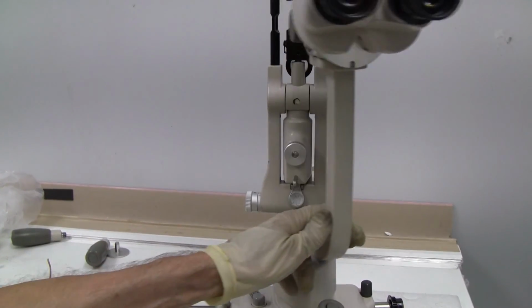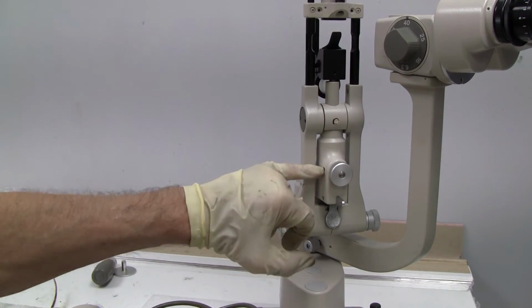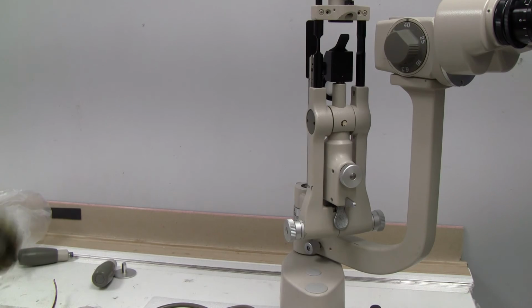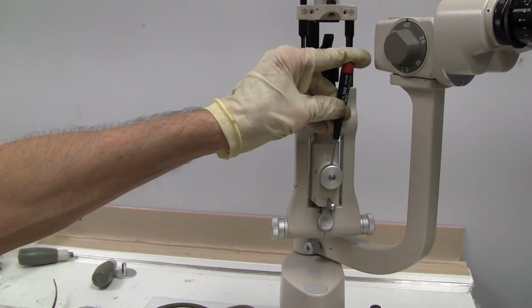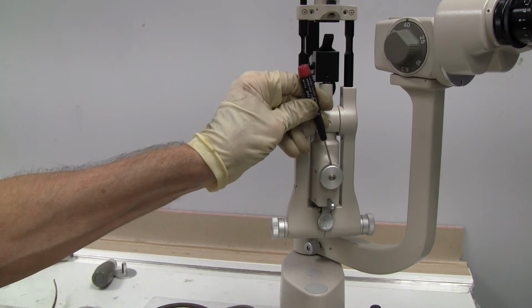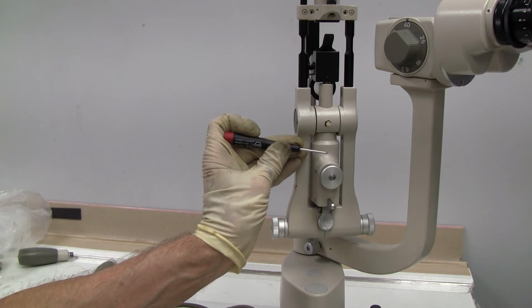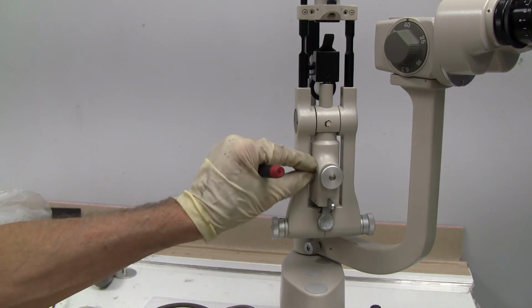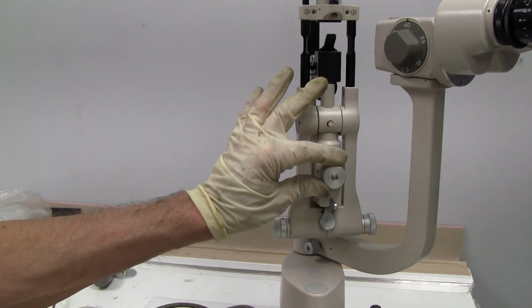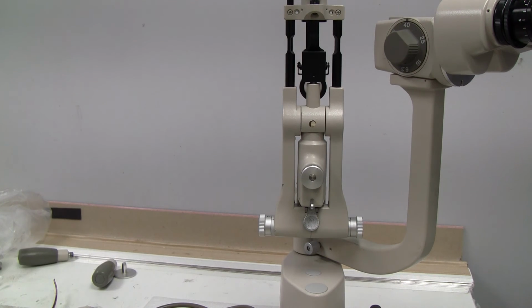you would need to adjust the centering, and that would be right here, where you would loosen your Allen, unscrew, loosen the centering knob, and then turn it with a little pointer one way or the other. Like if both eyes had to go to the right, then you would turn this little cam, you would turn it to the right just a little bit. You'd hold it, and then you would tighten your Allen wrench back up, and then tighten this up to see if it moved the way you wanted it to move, and it moved enough, or if it moved too much.